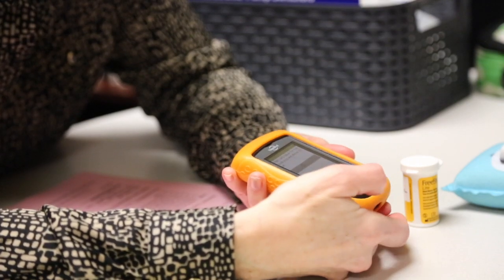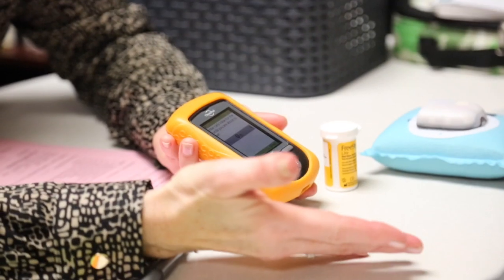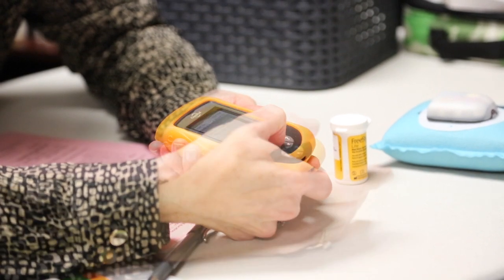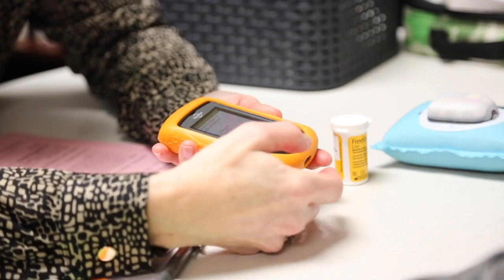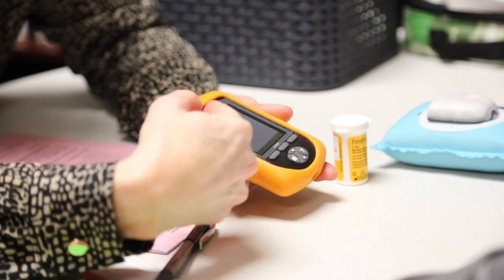That's what they do. And then you'd enter how many grams of carbs. Because right now, you're only going to the nearest one unit. Right. With this, we can go to fractions of units. Oh, right. But if it's actually 47, that's going to matter. So enter that, and then it tells you, do you want to use these values for it? It's kind of a double check.